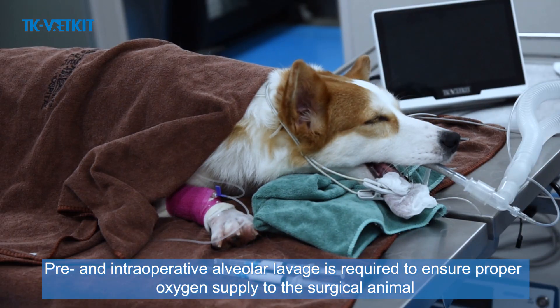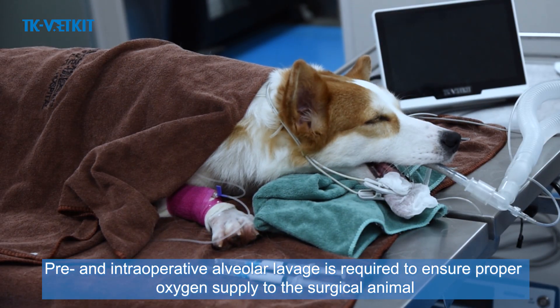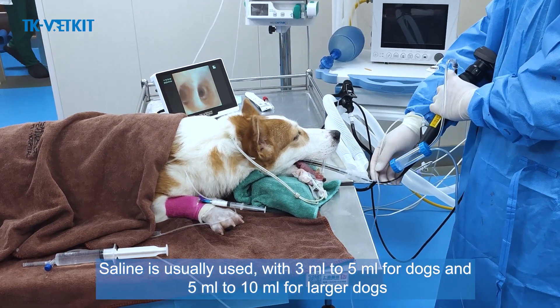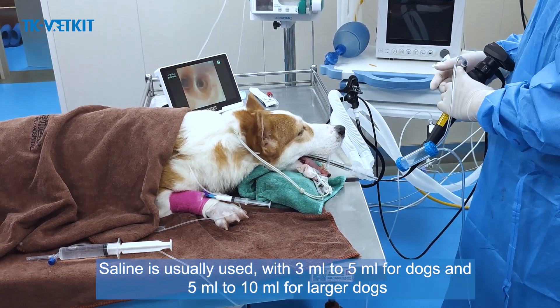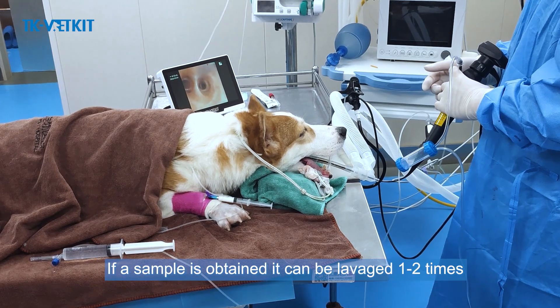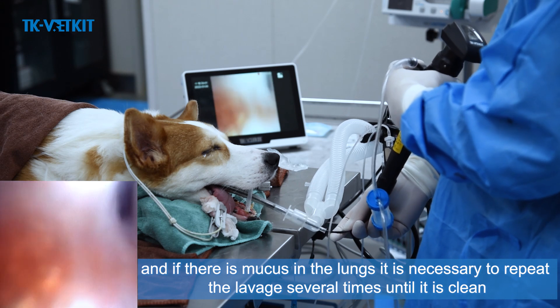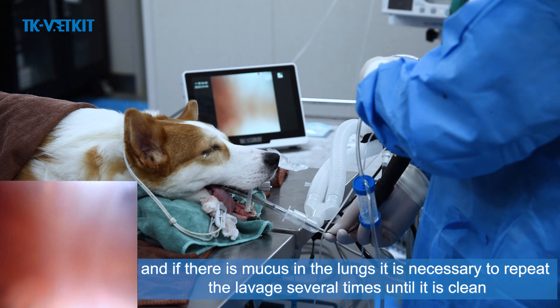Pre- and intraoperative alveolar lavage is required to ensure proper oxygen supply to the surgical animal. Typically 3–5 ml is used for small dogs and 5–10 ml for larger dogs. If a sample is obtained, lavage can be performed one to two times. If there is mucus in the lungs, it is necessary to repeat the lavage several times until clean.